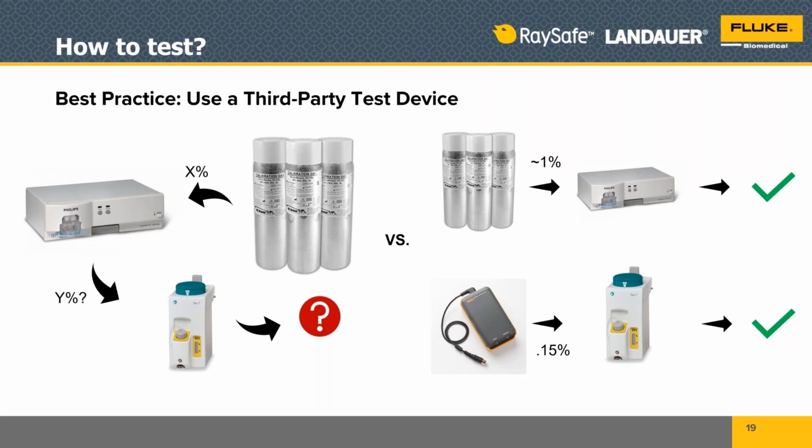A better way is to do it a bit more directly, because any link you take out of this uncertainty chain, we call it an uncertainty budget here, reduces the tolerance of the entire system. So if you just do calibrated gas on the respiratory gas monitor, you have about 1% inaccuracy versus that plus or minus 6% in the other example.